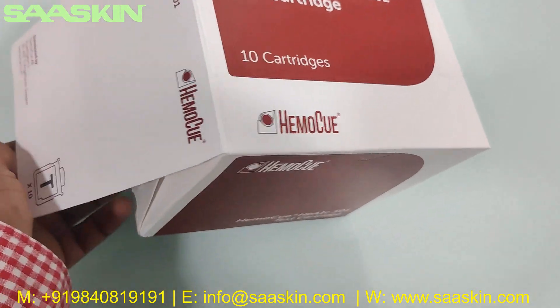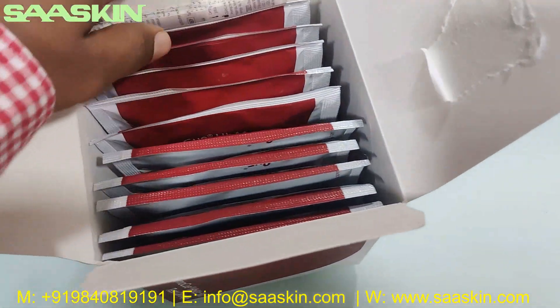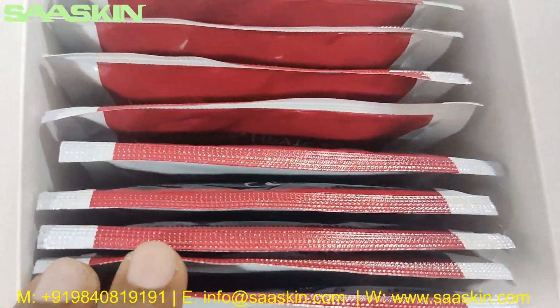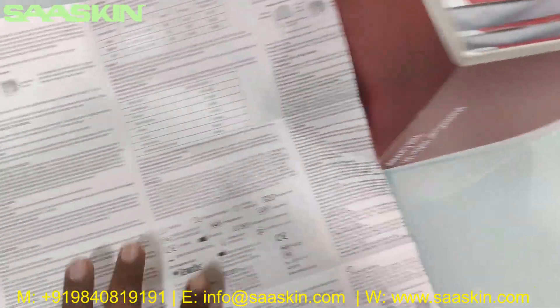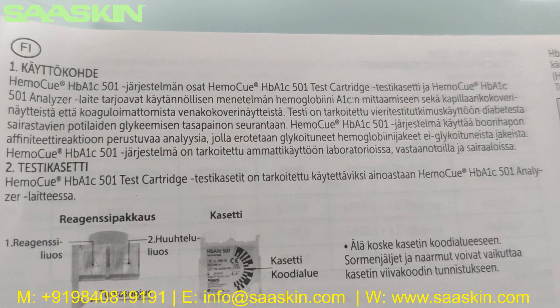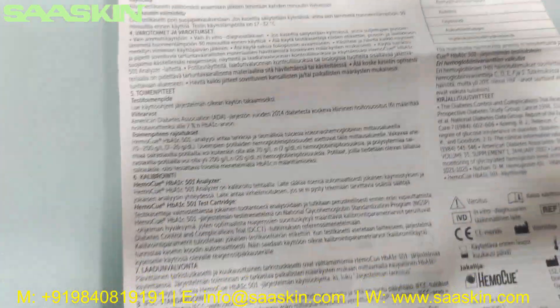Let me unbox this. Inside the box you have the 10 cartridges pack, and there is one detailed IFU brochure that gives you the complete instructions about the product and how the test process is executed. It says EmoQ HbA1c 501. You can see the complete introduction, procedures, and interpretation of the results — a complete instruction manual.